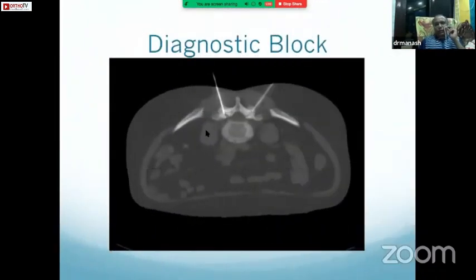So this is our patient. She came with left-sided severe low back pain radiating toward the thigh and up to the ankle at times, and she was not able to walk properly. It is only on the left side, but we had done a bilateral facet block in this patient. We did the perifacet block on the left as well as a neural transforaminal injection at that time.